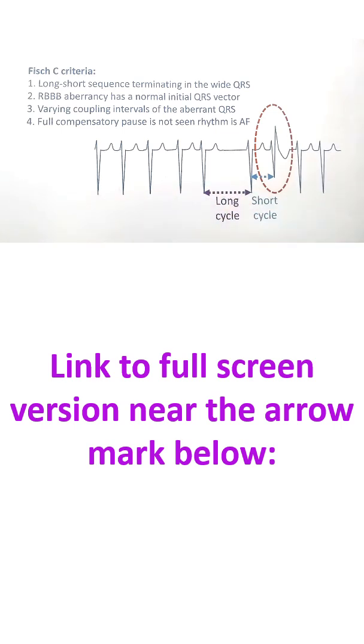This is a representation of lead V1. In V1 you can see that instead of the rS pattern, an RSR' pattern has occurred due to aberrancy.